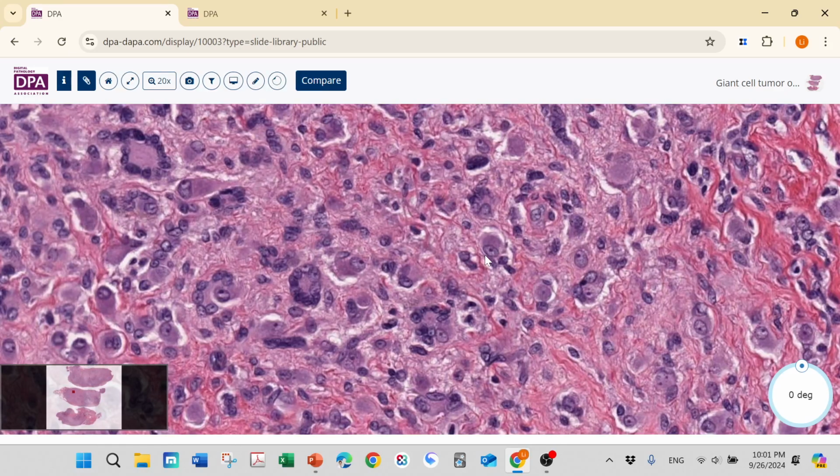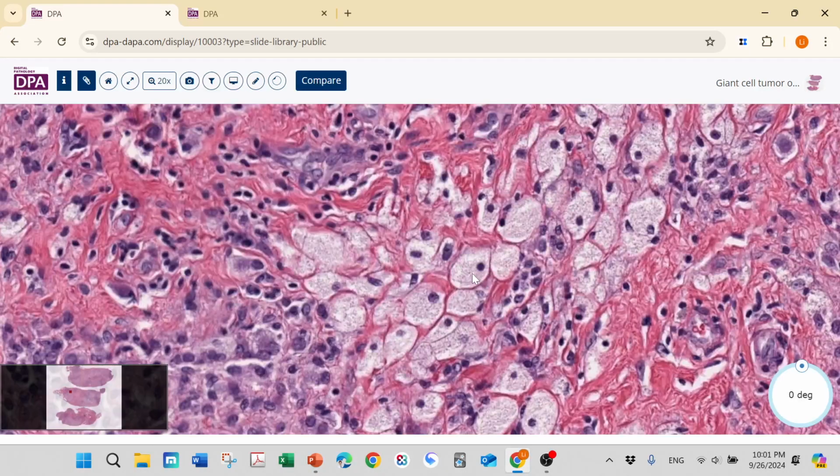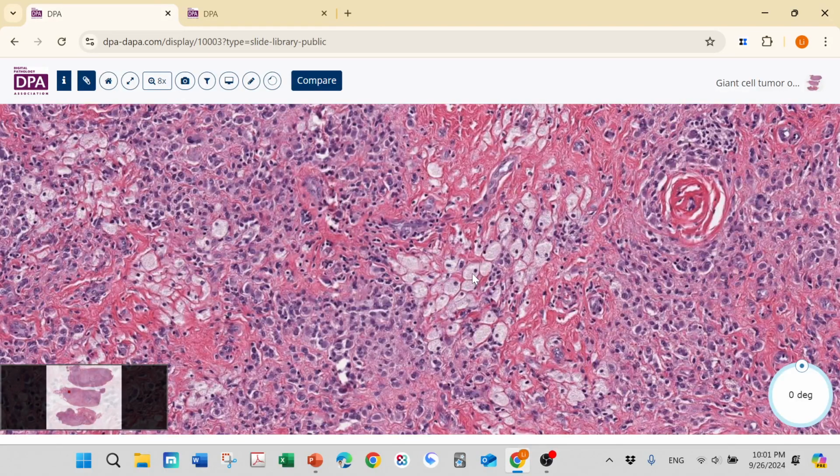What you should recognize is this histiocytoid, plasmacytoid, mononuclear cell. And then let's find other features. Even at this power, we can see this really sclerotic collagen background. Then we have this really foamy looking histiocyte, which supports our diagnosis. And we also like to show you one more feature. I think this is hemosiderin deposition, another feature.